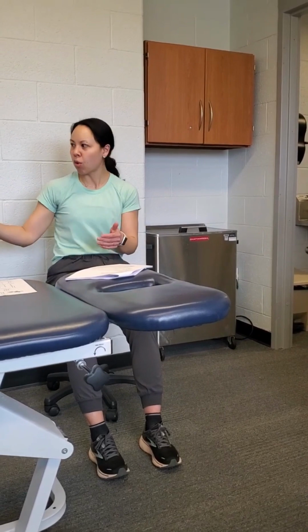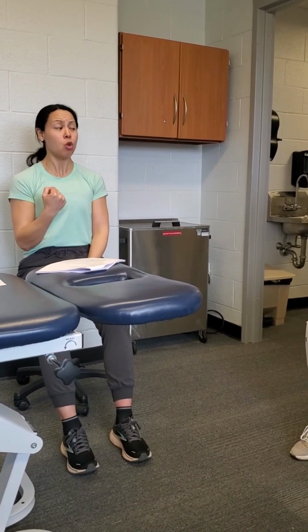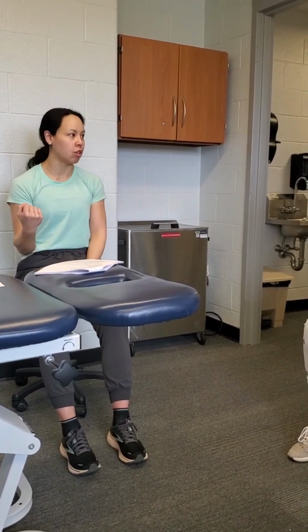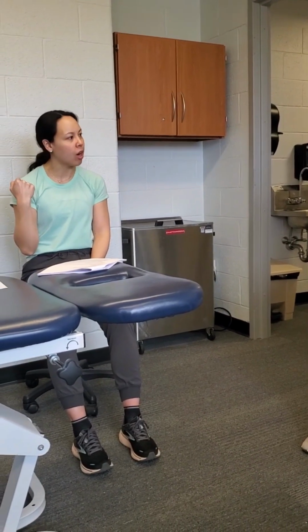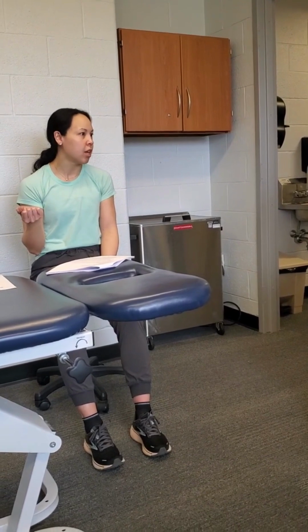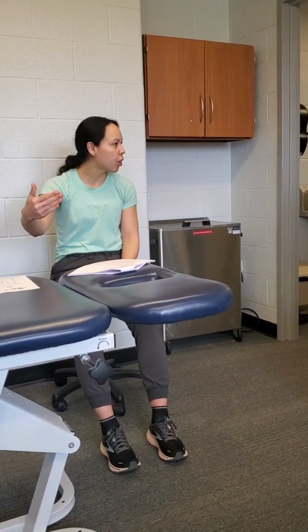I think the more you use it, you'll get a sense of what people can do with different exercises. I remember doing the bicep curl with a 2-pound weight, and I struggled to get through the 4th set. I couldn't have done more, and that was the appropriate load for me. Versus if it was easy and I was getting through the 4th set, and it was too light, I'd go up to a 3 or 4 pound weight.